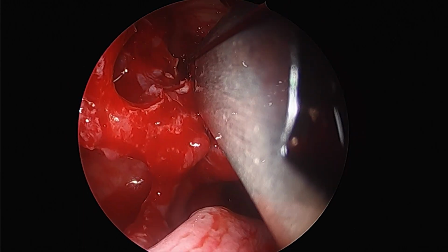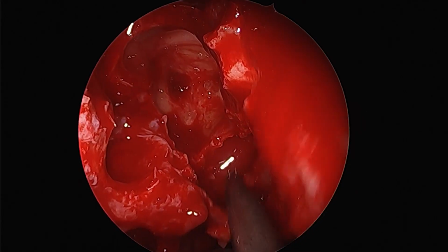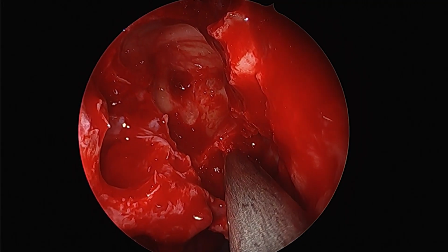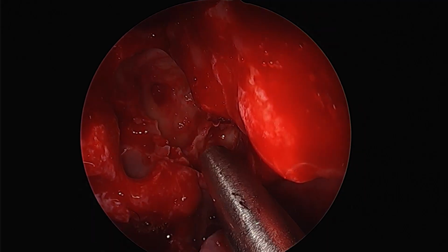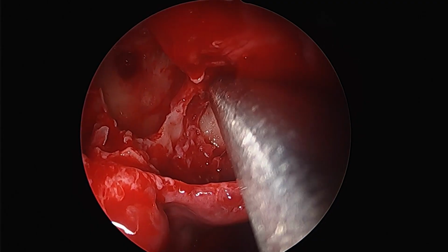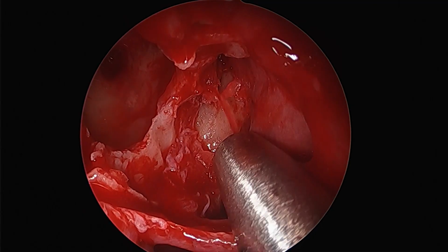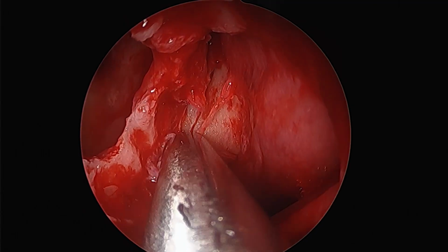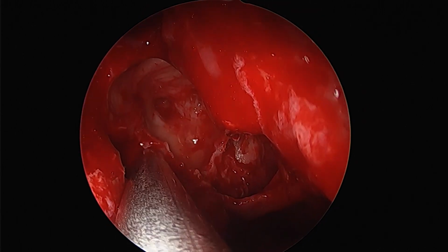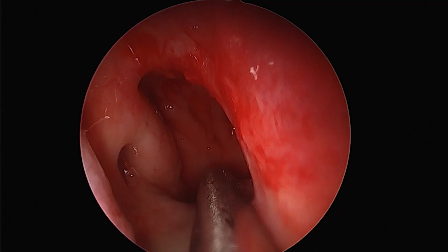And sometimes it does happen that the sphenoid sinus natural ostium is occluded or blocked, in which case we have to resort to a gentle pressure using a bone punch to increase the opening of the anterior face of sphenoid. But here, we are just over the choana, but the bone is very thick and it is practically non-yielding. We are neither able to insert a standard suction inside the sphenoid, nor are we able to insert a bone punch to take down bone from the face of the ostium, and we are also not able to take any elevator, which is normally the case that we do.